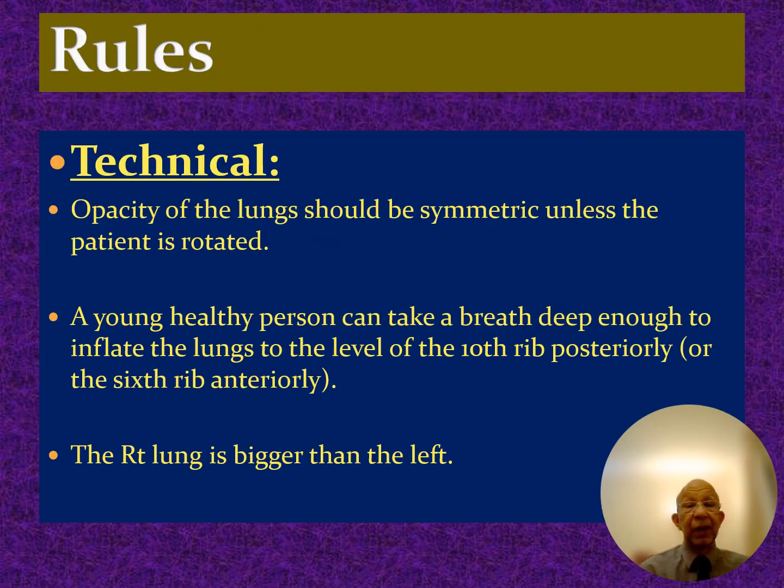Now let's go through a fascinating part of the talk. This is about highlighting the rules. If you know the rules, you're more likely to identify the pathology fast. But if you don't know the rules, you will just look at an X-ray and not be sure what's going on. So the important thing is to be aware of these technical rules.